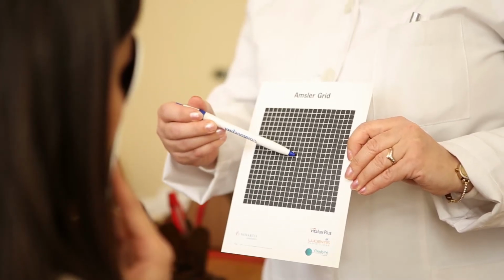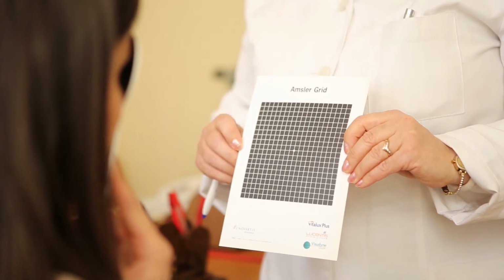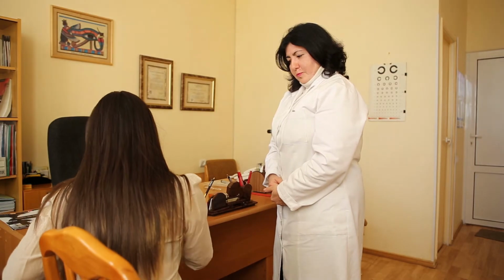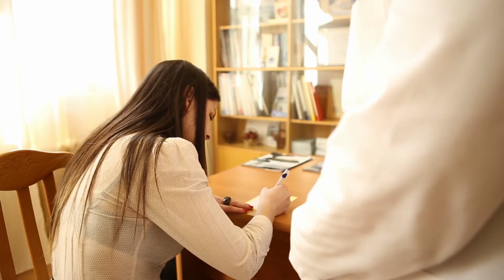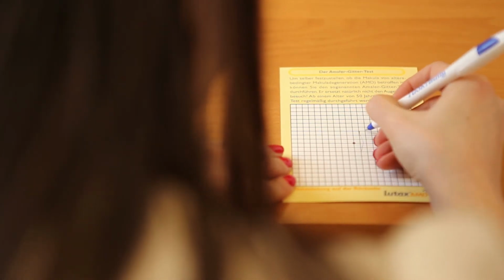Direct the patient to stare at the center dot and to report if any portions of the grid are blurred, distorted, or absent. The patient should not move their gaze from the center dot so that the presence of any distortion can be assessed. If visual disturbances are noted, the patient is a likely candidate for further studies.